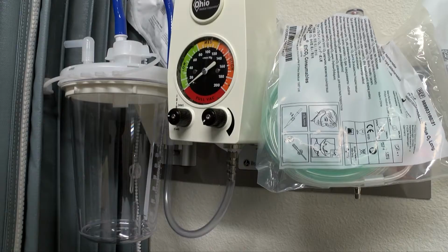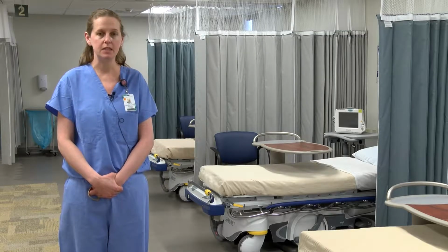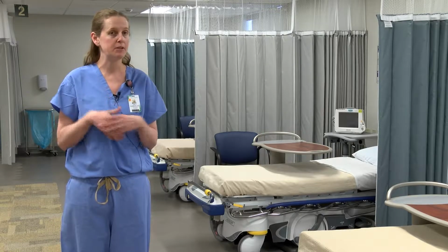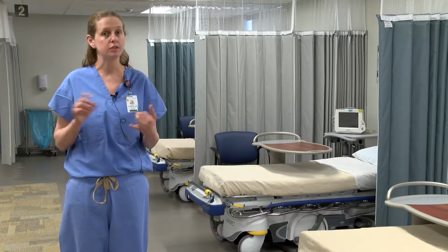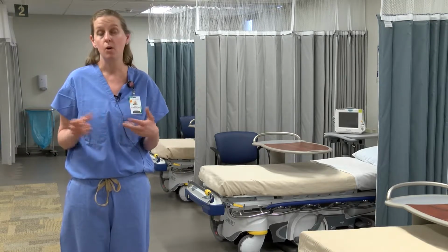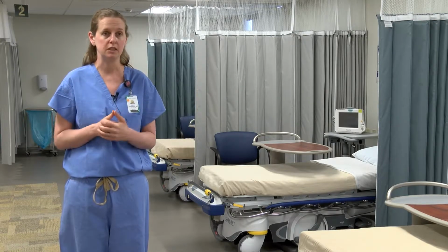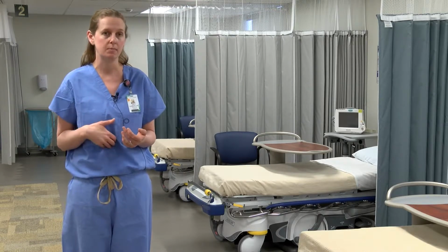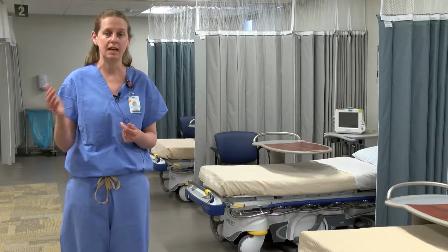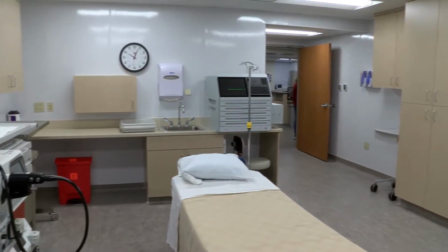So people who will come here are people who have been seen by their primary doctor and needed to have either an upper endoscopy to look in a stomach for stomach problems, or they're here for a colonoscopy either for screening for colon cancer, or if they've had symptoms, or if they've had a history of colon or rectal cancer. So patients will come here for those procedures, and those procedures use small flexible scopes to look inside at the esophagus, the stomach, the small bowel, as well as looking inside and looking at the rectum and the colon, trying to find if there are any problems or cancers.